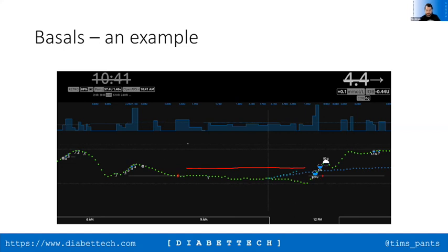So given that, we can also see that the basal rates here are being held back a bit, and we can see that there are SMBs taking place here. So that's roughly 7 a.m. So we'd expect the DIA on those to run out to around about 12.